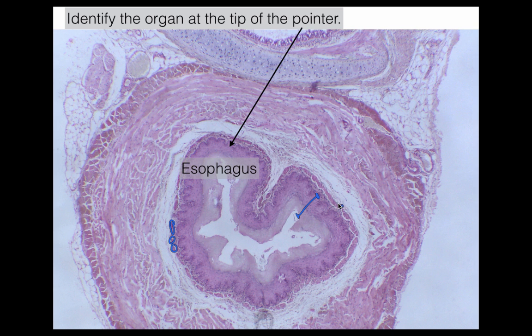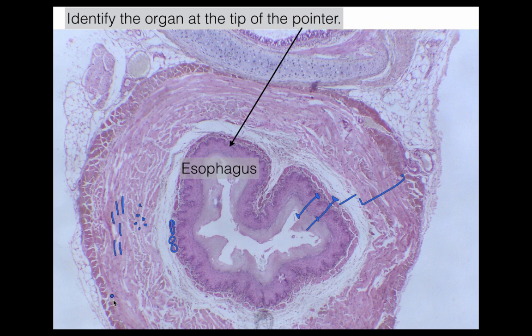Remember that the tunica mucosa goes from the whole epithelial layer through a small connective tissue layer and all the way through the muscularis mucosa. The tunica submucosa is here, and then we have the tunica muscularis — all this muscle layer. You can actually see two different layers: one cut transversely, where the fibers are coming out at you, and one cut longitudinally, which in this case is the outer longitudinal muscle. So we have the inner circular muscle and the outer longitudinal muscle.